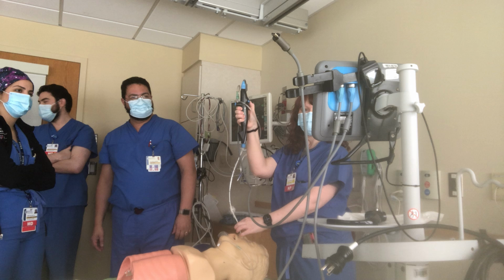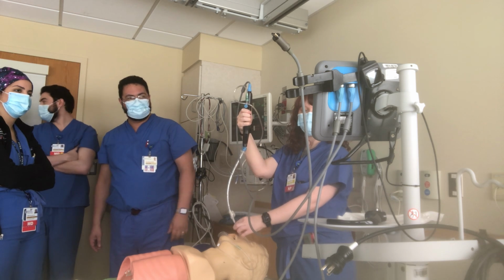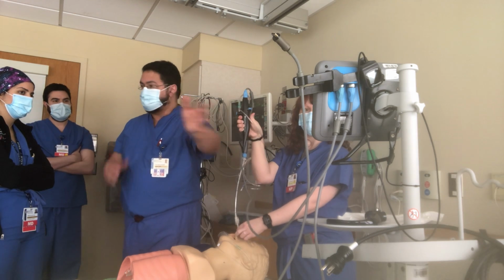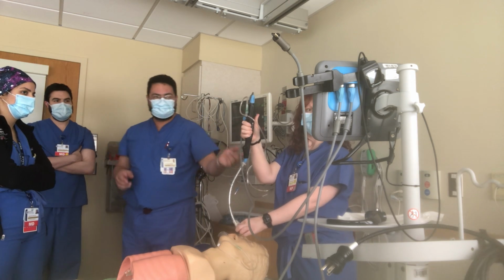Yeah, turn it a little bit. It's not in the middle of the screen. Yeah, bring it to the middle. Push. Yeah, you have to take your time when you do this. If you are rushing, if this is not exactly in the middle of the screen and you push, it's gonna go in the wall and make the patient cough. You have to be exactly in the middle.